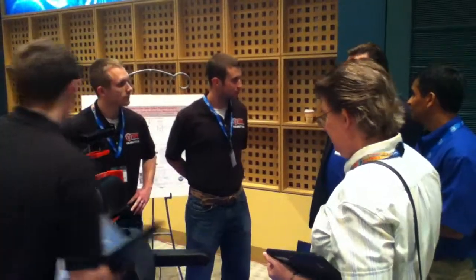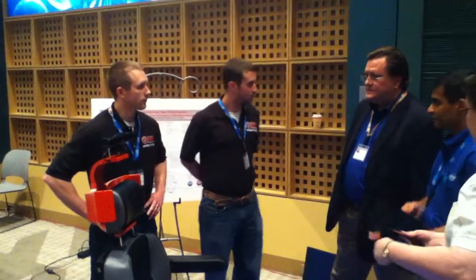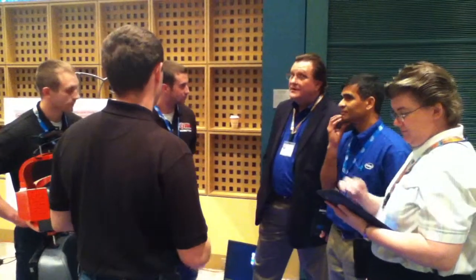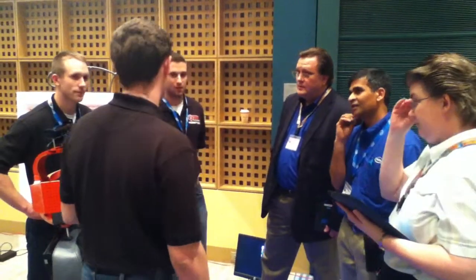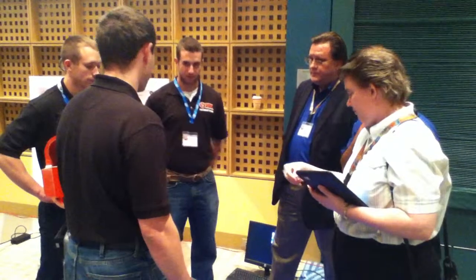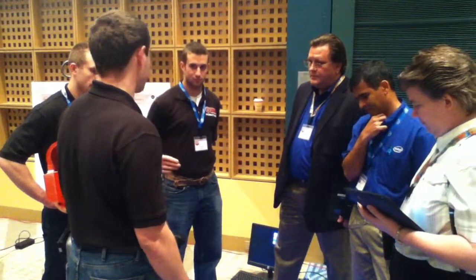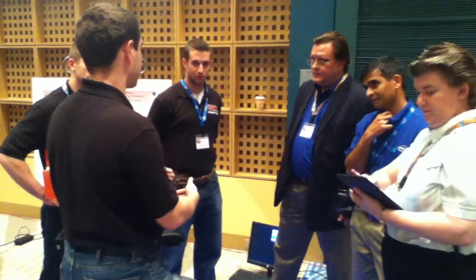Do you make doorways autonomous? It's semi-autonomous. You just have to hold forward. So if you want to go forward, it's going to figure out how to get you through. Yes, and that is cool. That behavior stems from the wall following, and the lines display the fact that it will turn you parallel to walls, and doorways between your walls.